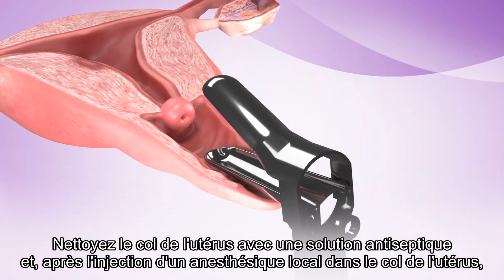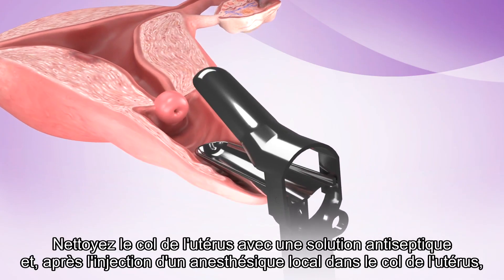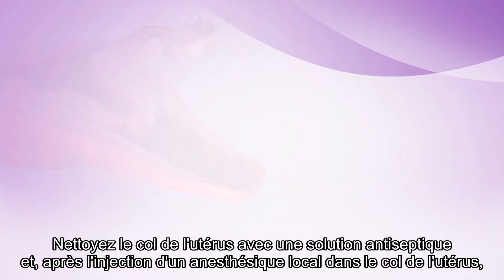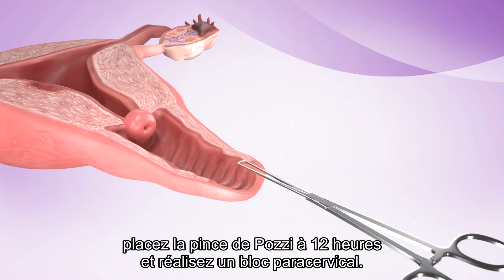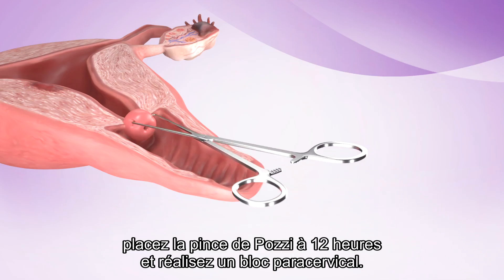Clean the cervix with antiseptic solution, and after injection of the cervix with local anesthetic, place the tenaculum at the 12 o'clock position and perform a paracervical block.